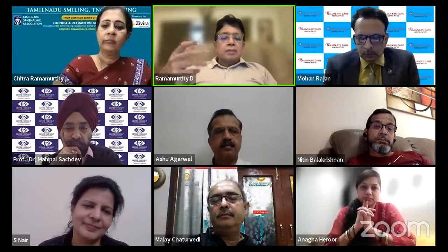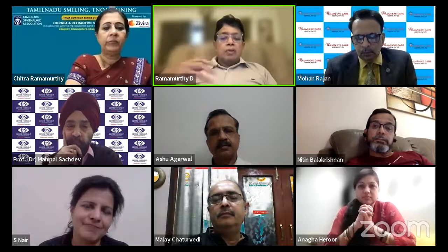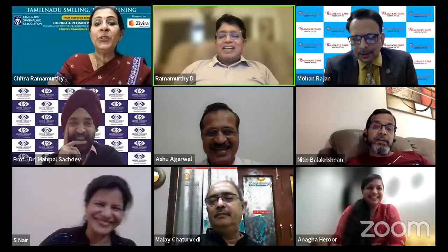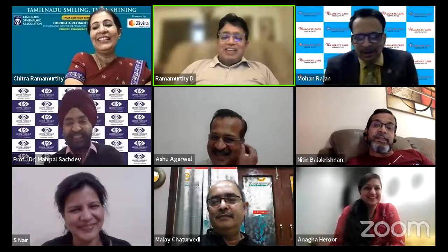But I think internationally, people are giving up using the lasers for creating incisions, and we are not doing anything wrong to the patients by doing that. No, but Ram, your frank opinion, I don't know, Swapna is a loyalist, she's stuck on to the Lensx still, but are we not getting fewer of these capsular problems with the Catalyst? No, absolutely. I was wondering how you didn't bring this up. I wanted to ask the same question to Swapna. They're using Lensx. You took a long time in bringing it up. We have not had this problem with the Catalyst, all this rhexis problem.